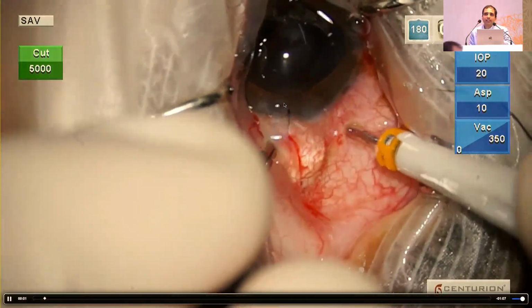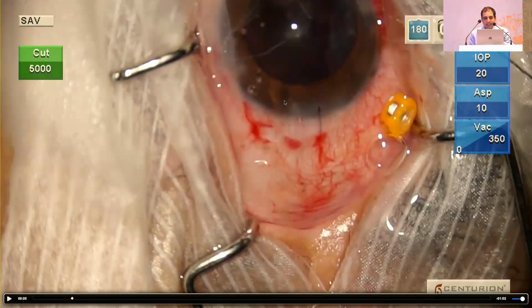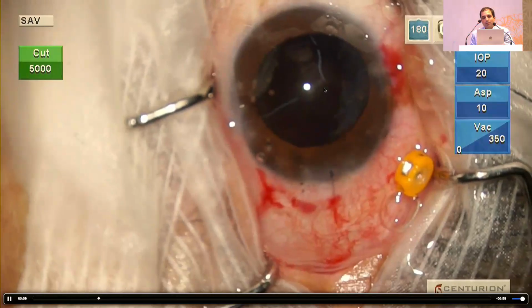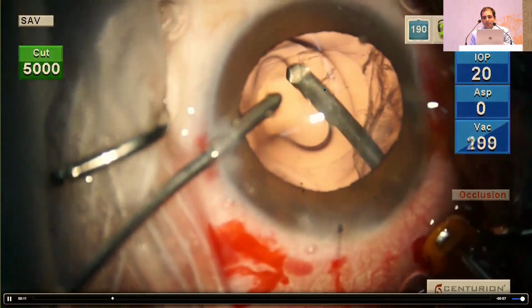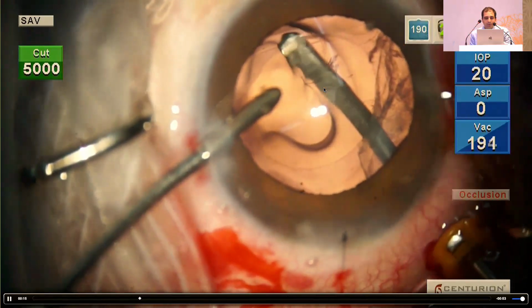Wherever and whenever there is a vitreous disturbance that you suspect, you must tackle it at that point of time. And even this was a 2.2 millimeter incision. I sutured that wound before I injected the trocar so that the globe is relatively well formed. You need a good anesthetist because this patient was under topical anesthesia, so he was sedated more.